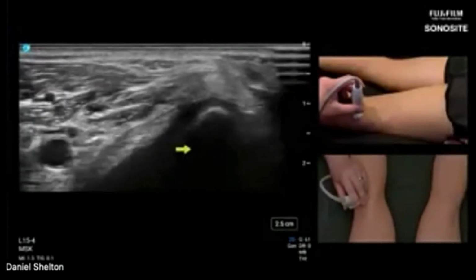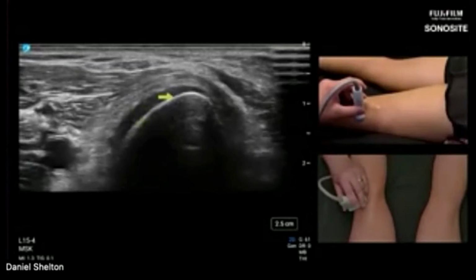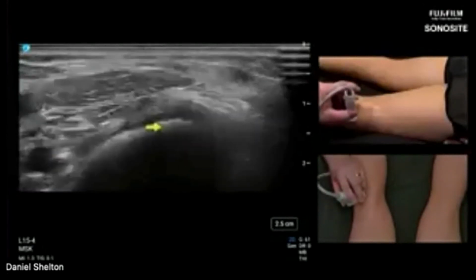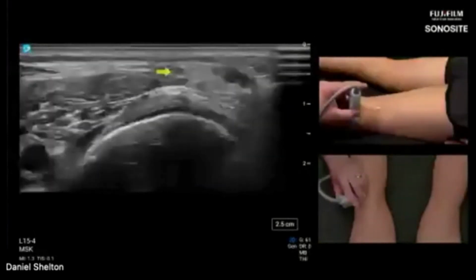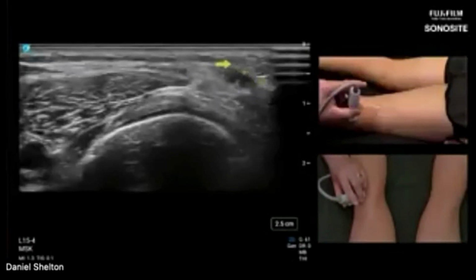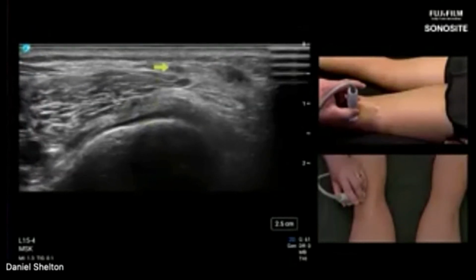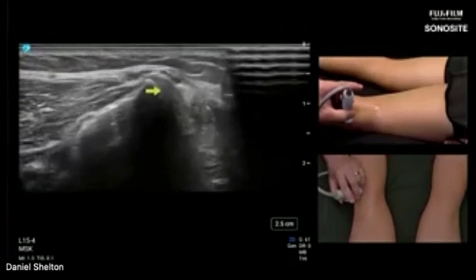Okay, so I'm at the bony level of the lateral femoral condyle. Now I'm going to go distally, and now I'm over the joint line. And now the next bone is tibia. Okay, and if you've been following that nerve, it's this more flat shadow right here. Here's the biceps femoris right here. So nerve, tibia, and now we're about to see that posterior fibular head be this very superficial bone that's about to come up in the shot right there.